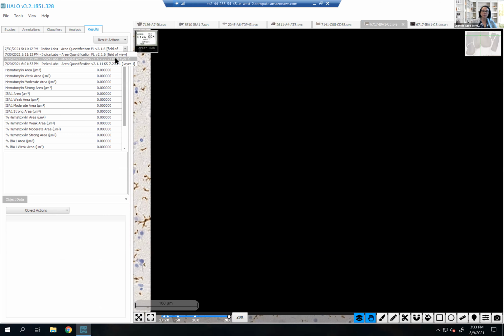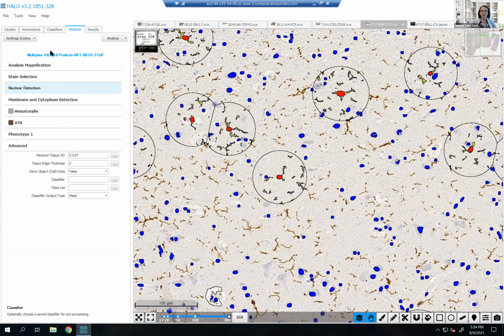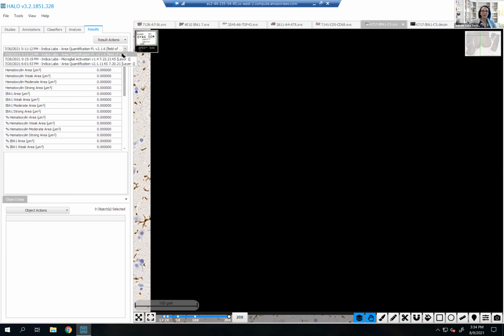And I want to show you the microglia activation. So in the microglia activation, you can enter the information. Sorry, I forgot to load it. I'm so sorry.